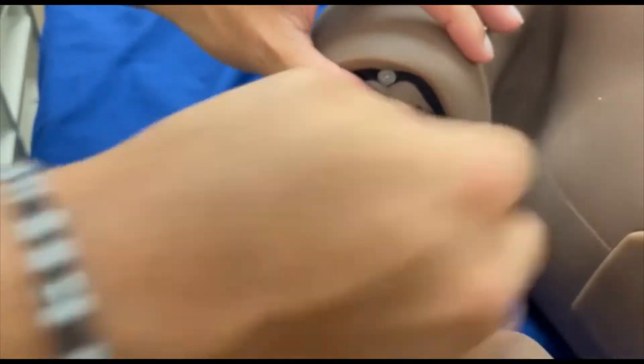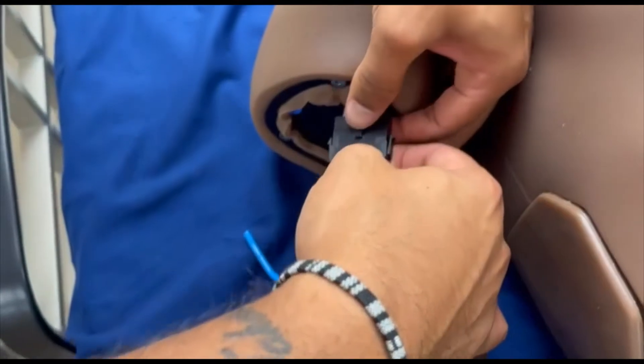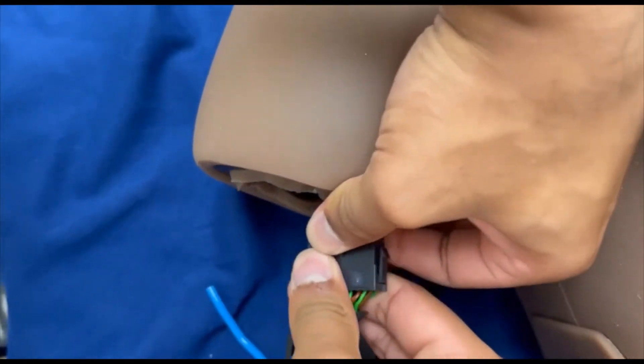To detach the cluster of wires, just gently pull apart. Then it's detached.